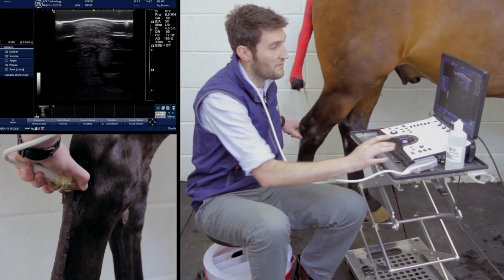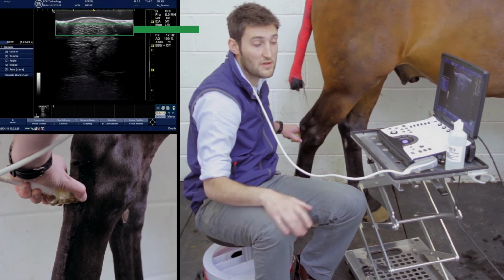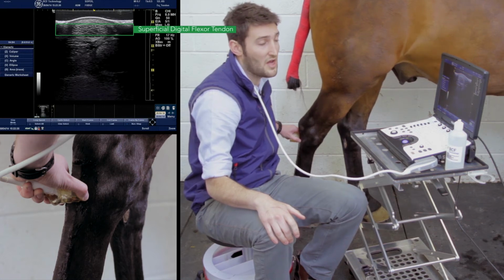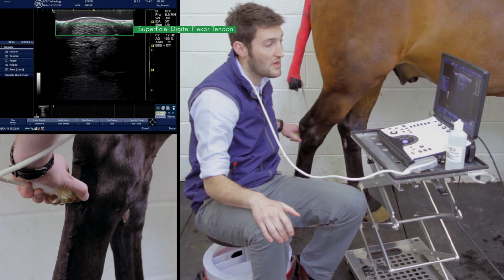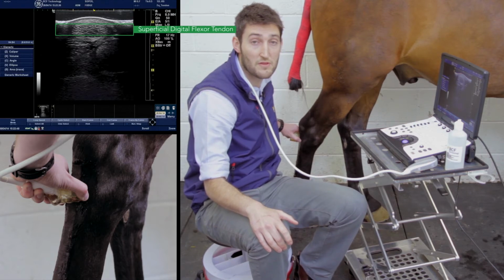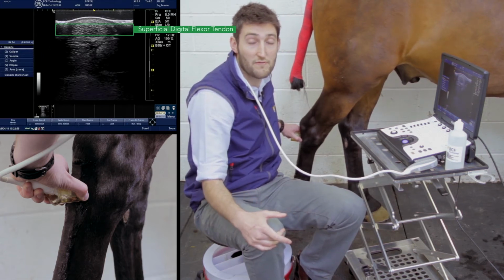If we unfreeze and just start to come distally, we find we have superficial digital flexor tendon in the middle, and I can freeze that. We can see most of the extent of that. We find if we want to get the medial and lateral borders, we may have to rock the transducer just medially and laterally slightly. But what we can't really see is much of the deep digital flexor tendon and the plantar ligament. That's because the plantar ligament lies laterally and the deep digital flexor tendon lies quite medial at this stage. So what we need to do then is adopt almost a 3-pronged attack in terms of scanning, so that we make sure we view all of those structures.